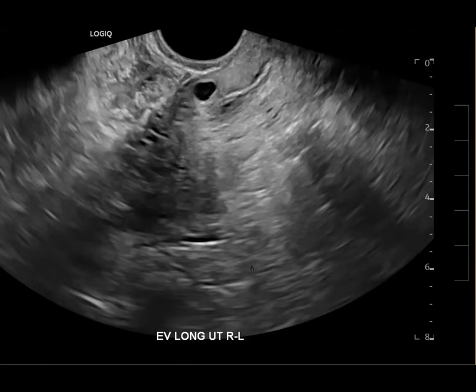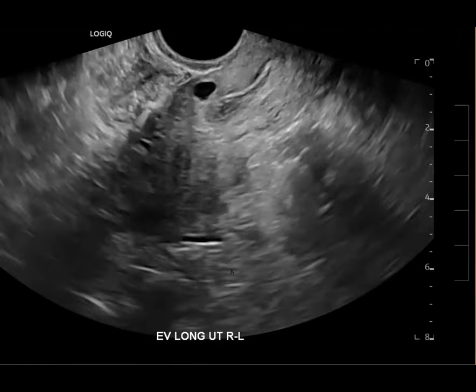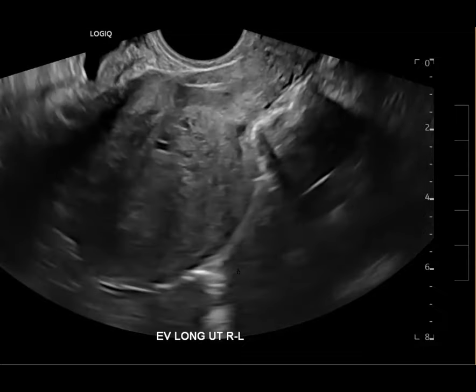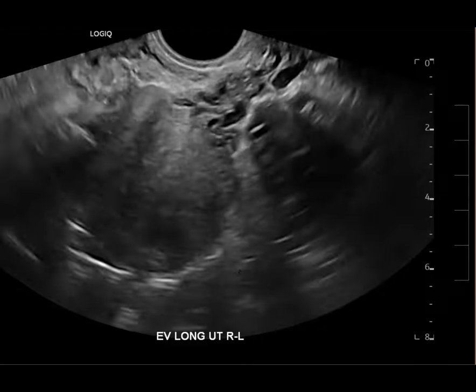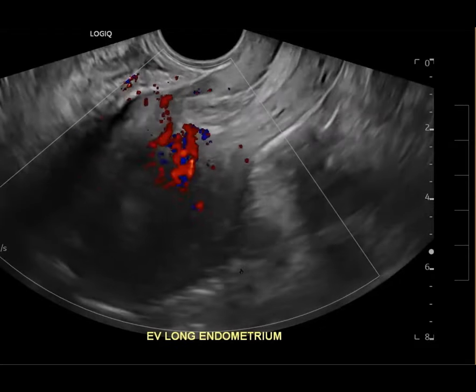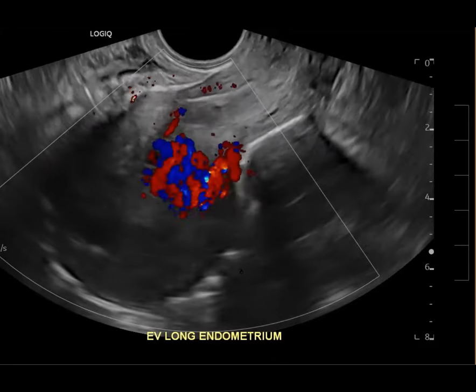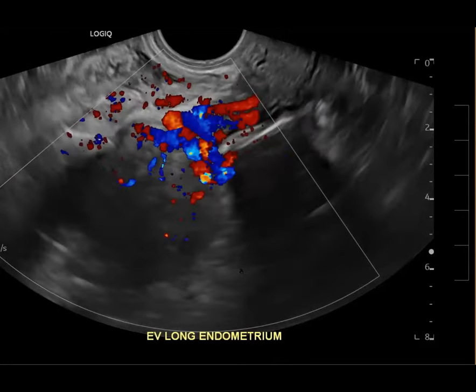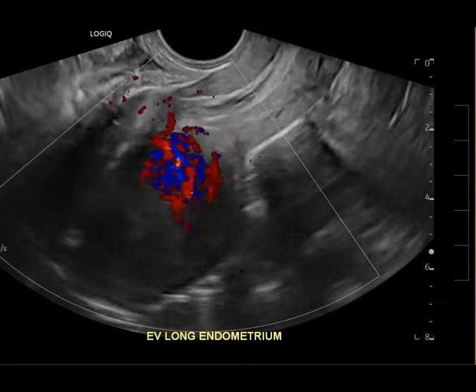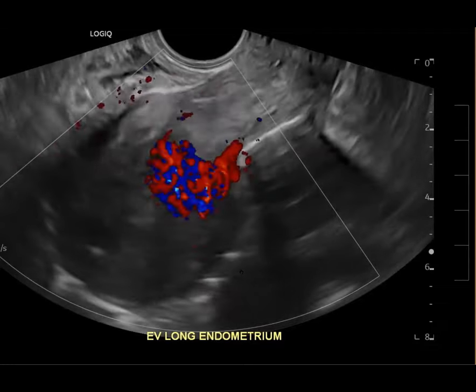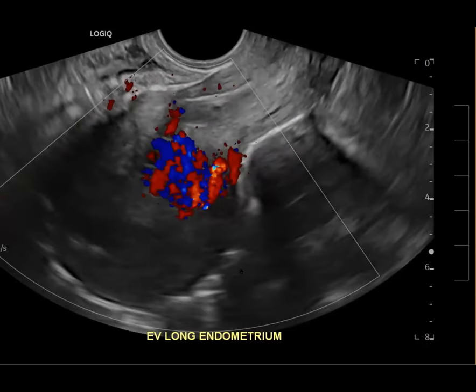This is another case — a companion to the uterine AVM case shown earlier, but an ultrasound version. History of spontaneous miscarriage and status post D&C. It's a really pretty ultrasound image that was confirmed later on MRI pelvis. When I presented one of these a few weeks ago, it was also about distinguishing it from retained products of conception — this is clearly centered in the myometrium versus an expanded endometrial lesion.